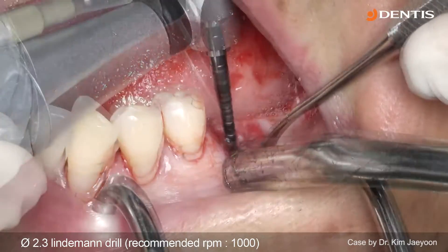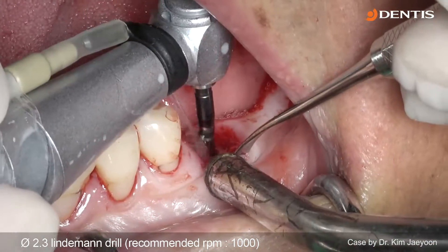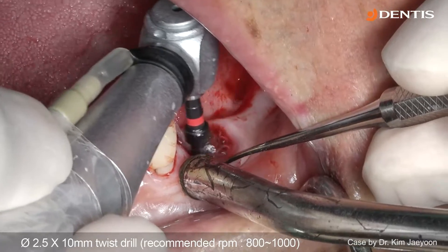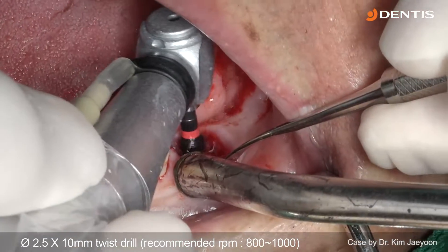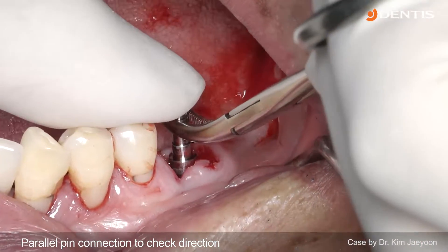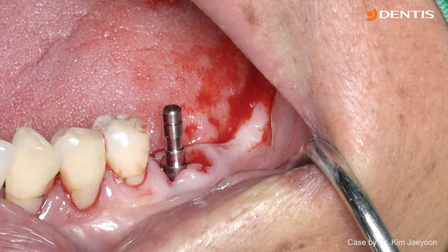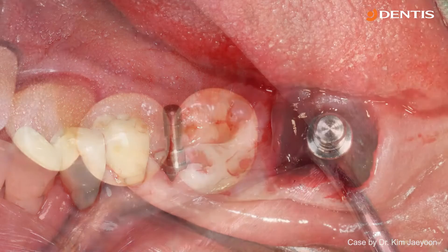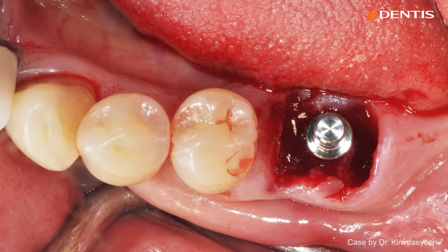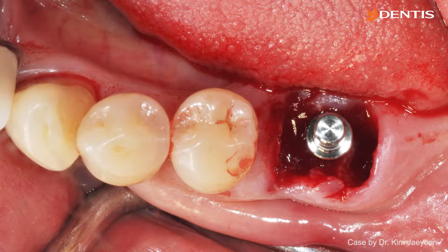I start with the Lindeman drill. The site is the septum area, followed by the first twist drill. I always check the parallel pin to confirm the site and the path. As planned, the initial drilling point is on the septum area, 5 millimeters behind the premolar.